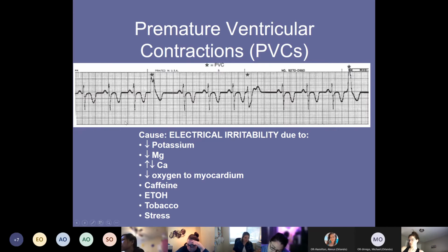This is a terrible looking strip. I am really concerned for this patient, okay? There's so much going on with this strip. But again, where do we start? Try and find the most normal looking beat you can find, okay? I'm just going to start here because I see a P wave, okay? So the SA node is firing. We've got a nice normal QRS here. We've got an inverted T wave. That's not good. This patient needs to be in the cath lab.